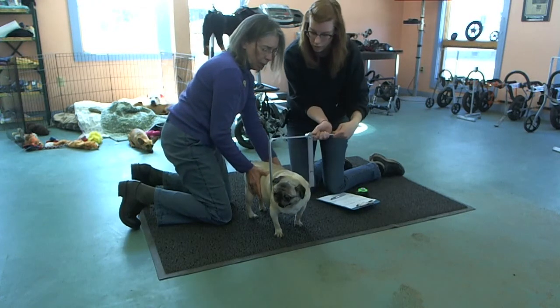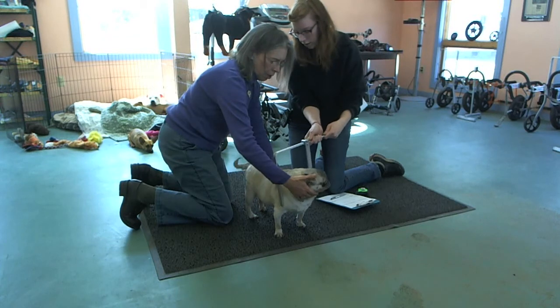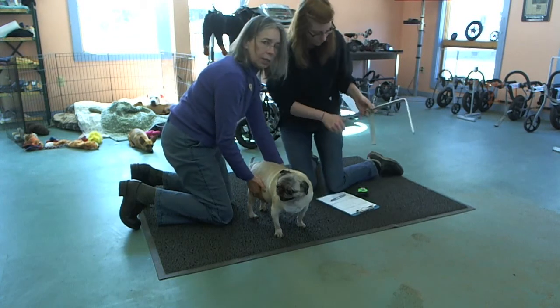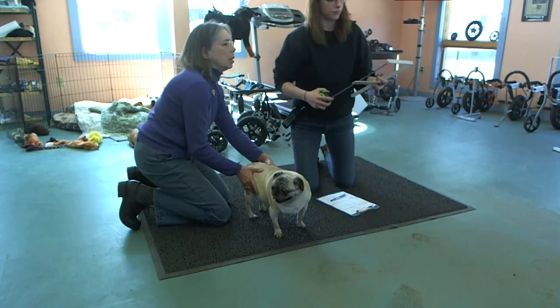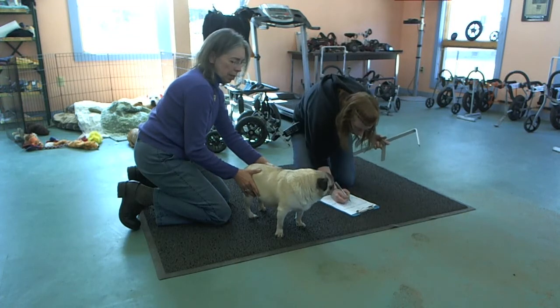Now for E, we're using our caliper. Take a stretch straight. You want to brush the top of the fur — we don't want it to be too tight. Think of this as a comfortable jean set. Seven and three-eighths.